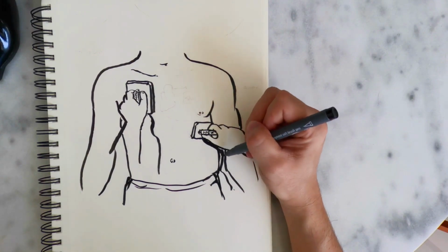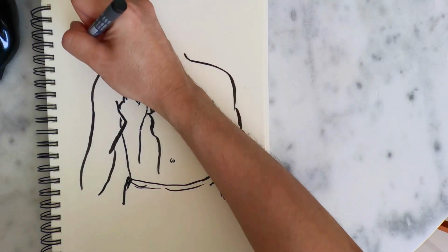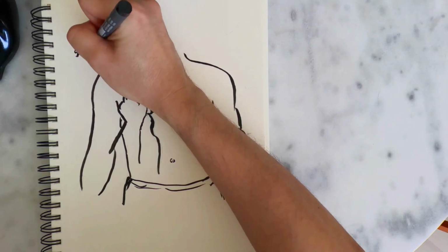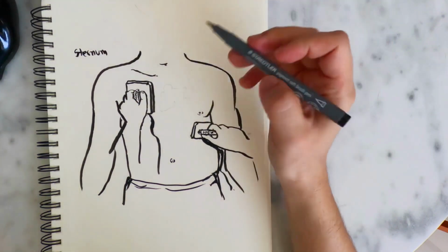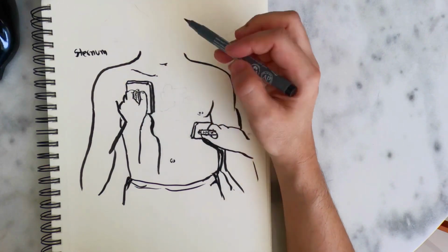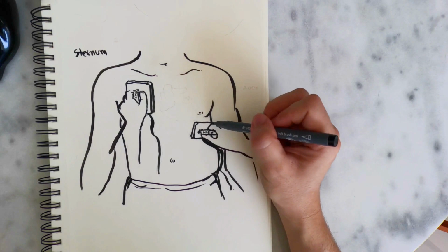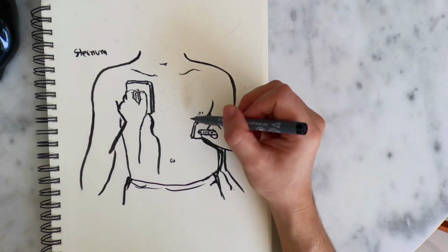We deliver a shock to the patient with 200 joules of energy, but some of that energy is lost to the metal of the pacemaker, which is made of steel, so the shock may not be effective. Therefore, we should slightly adjust the position. We can still place the pad on the right side, but we should not overlap them. Keep them about an inch apart if possible.